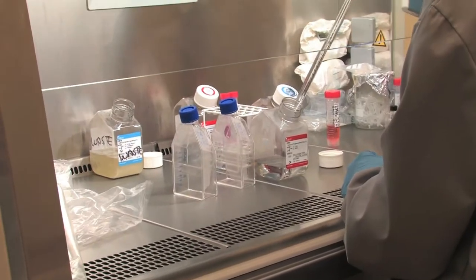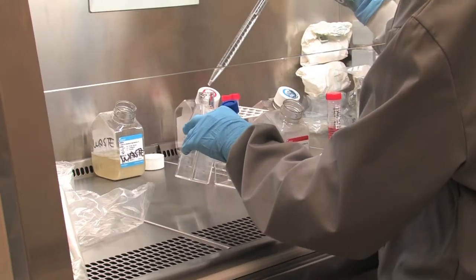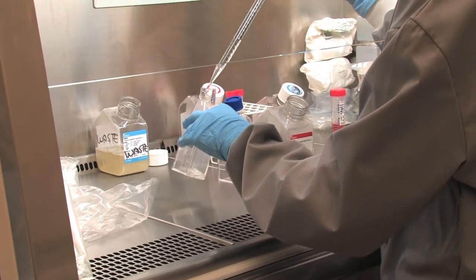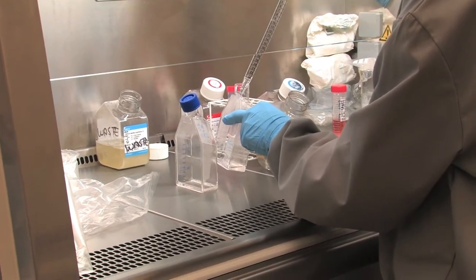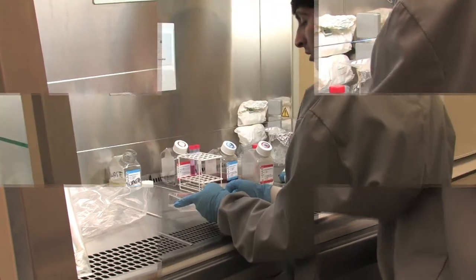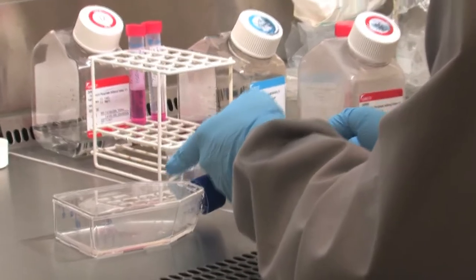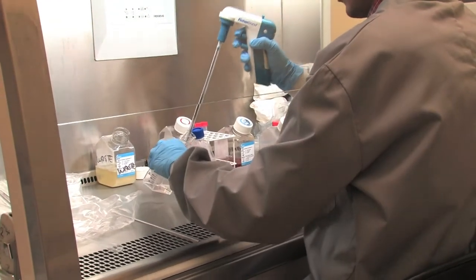Cells are washed with DPBS. Approximately 5ml per 25cm² culture surface area of DPBS is added to each culture flask from the side of the flask, opposite the attached cell layer. Consequently, the layer of the attached cell surface is washed with DPBS by rocking the flask side to side. DPBS is then removed and discarded.